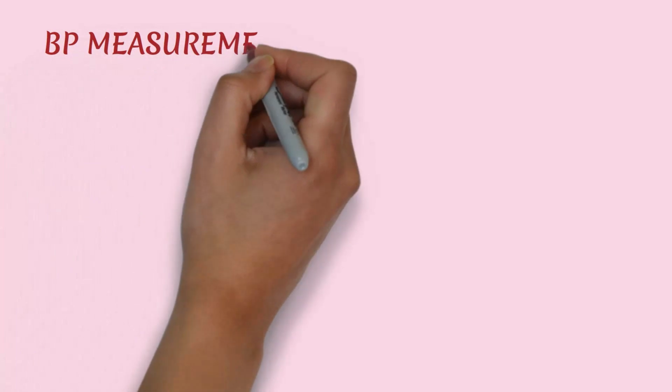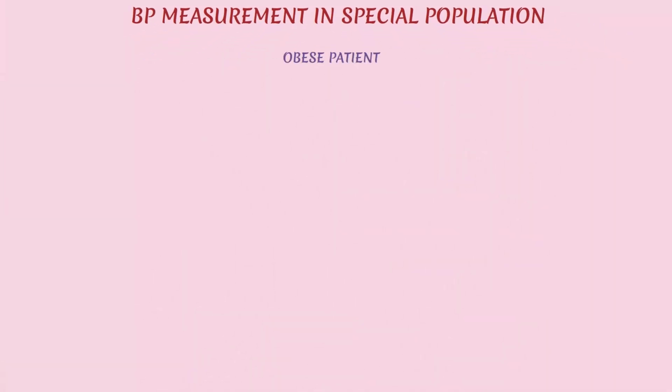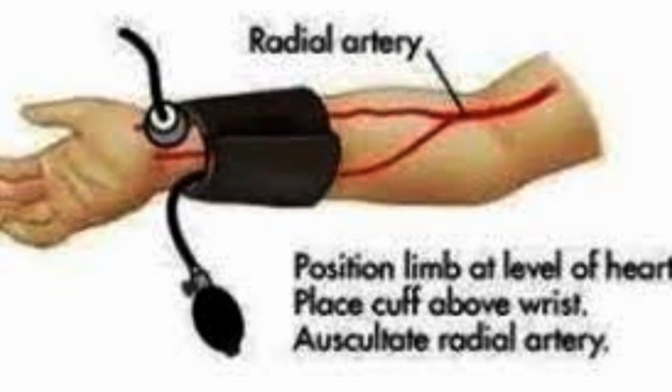Now we will discuss BP measurement in special populations. Obese patient. In obese patient, the cuff size is typically small. If an extra large cuff does not fit on arm, BP can be measured on forearm using radial pulse.